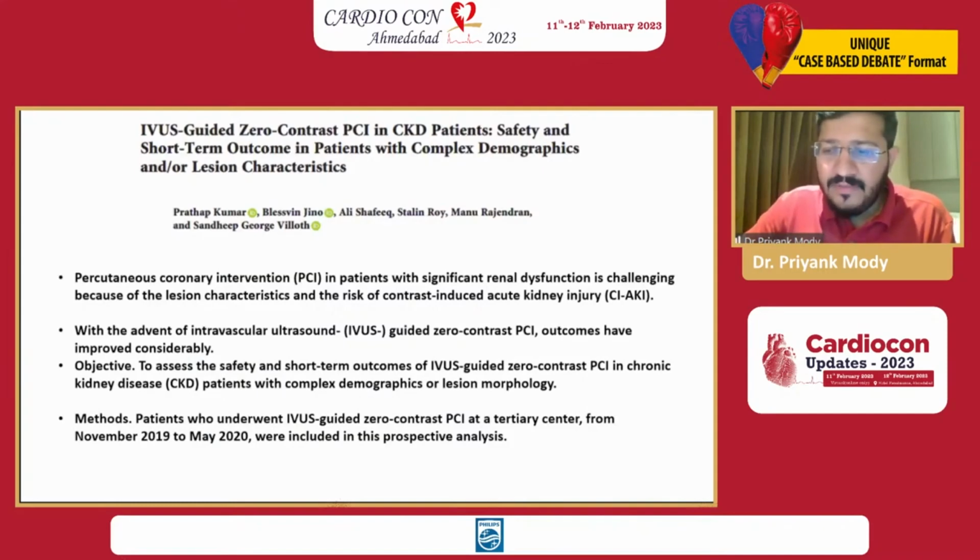I think Dr. Zayed Ali was one of the initial people who had a paper published on zero contrast angiography or angioplasty. Our Indian data comes from Dr. Pratap Kumar. He did a study in the 6 months between November 2019 to May 2020, where he included 15 patients.